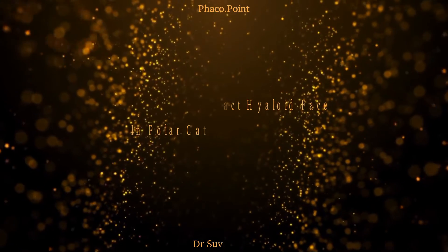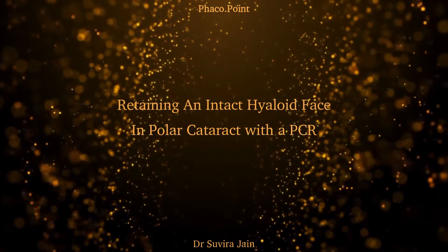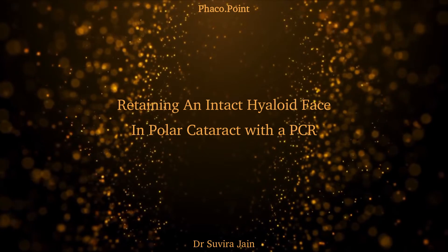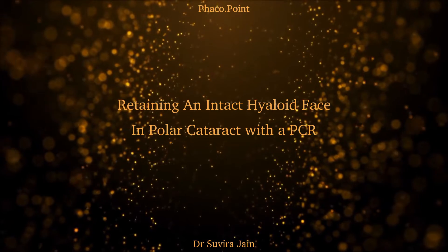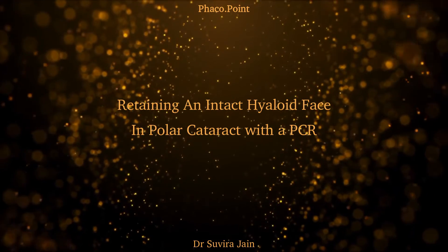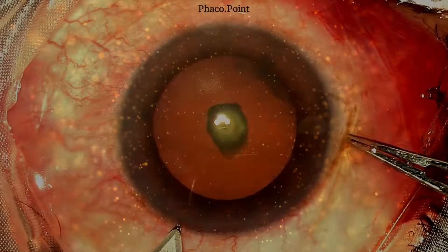In this video, I'd like to discuss how, when faced with a posterior capsular rupture in a patient with a polar cataract, what are the various surgical steps we can perform that can prevent the herniation of vitreous, thereby preventing vitreous loss and helping us retain an intact hyaloid face. Let's move to watching the surgery.